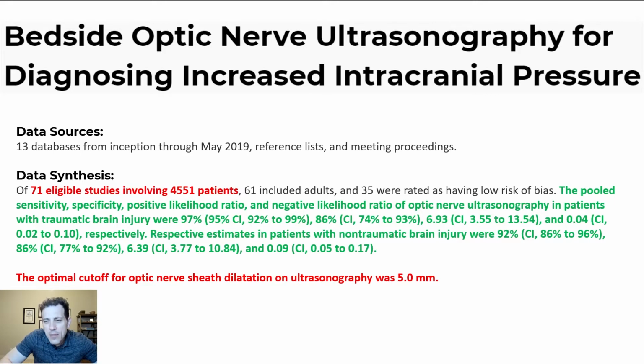What they found was that the pooled sensitivity, specificity, positive likelihood ratio, and negative likelihood ratio of optic nerve sheath ultrasonography in patients with traumatic brain injury were 97%, 86%, 6.93, and 0.04. And when these same metrics were looked at in non-traumatic brain injury patients, they were very similar.